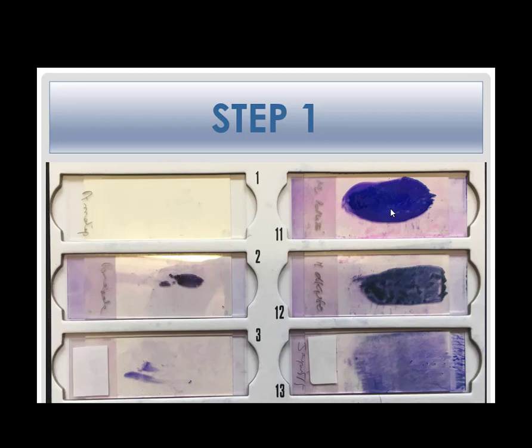Cytologists often say that the colour blue is associated with the presence of lymphocytes. It's not always true, but it's worth keeping in mind. This slide is dense, and it is possible that the cell detail may not be visible. This one here will possibly provide the best information, because you can see that the material is well smeared across the slide. The cell detail should be visible.